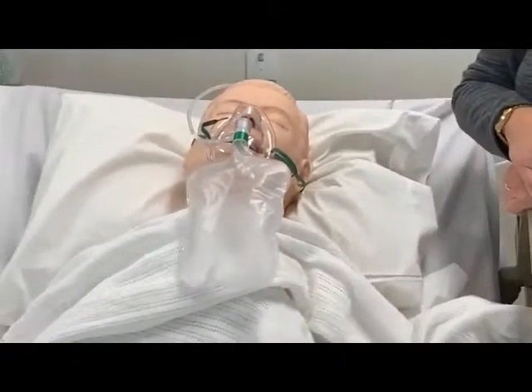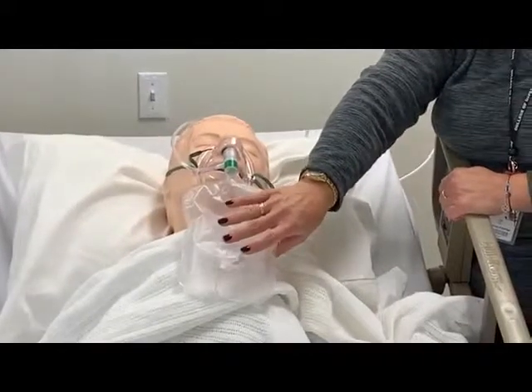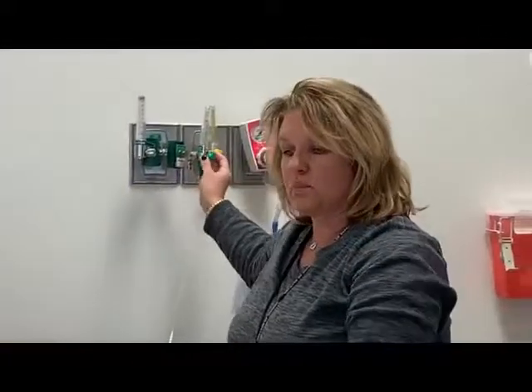The other important thing to mention is that if you're watching your patient breathing and you're seeing that this bag deflates when they're taking a breath in, you're going to want to increase your flow a little bit to be able to meet those demands for that patient.